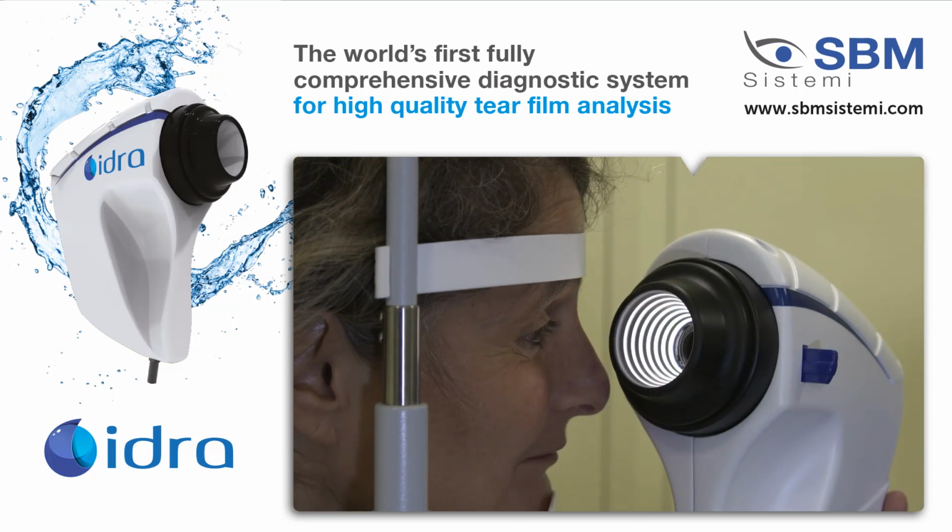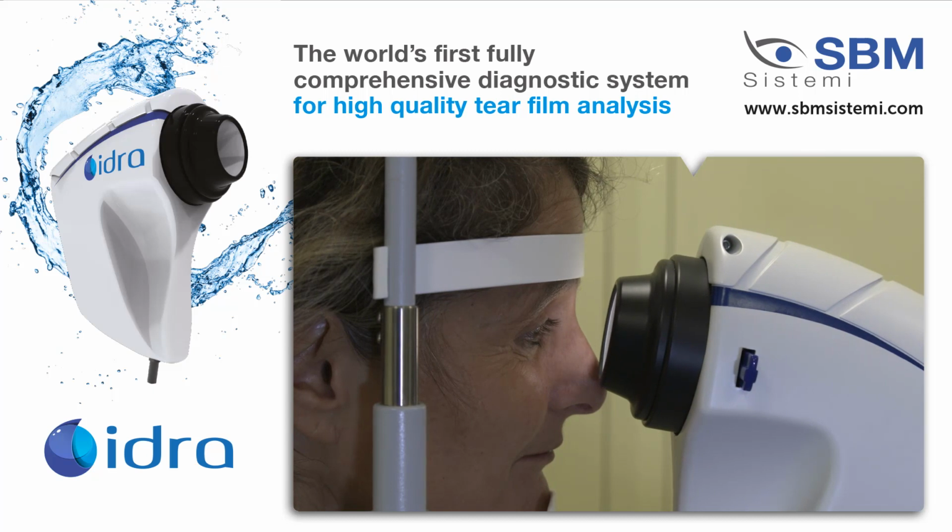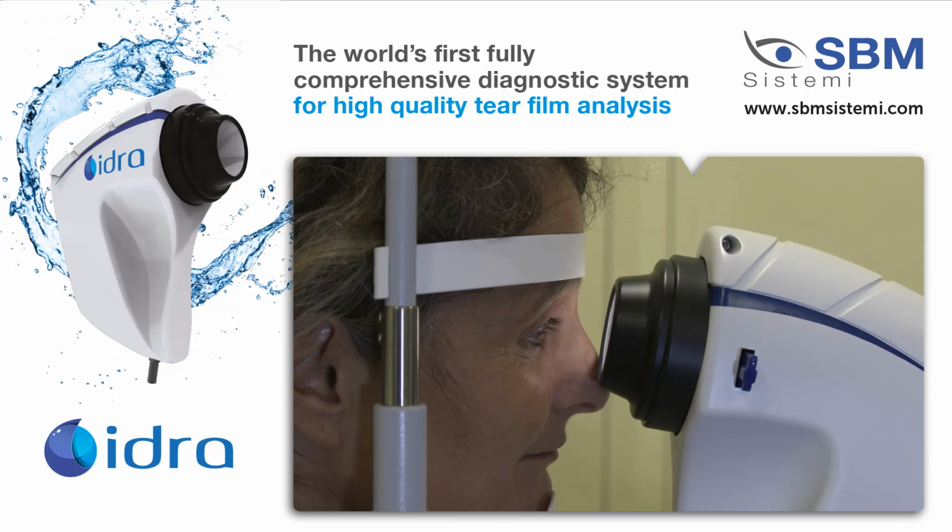To perform the non-invasive tear breakup time, we use the Placido disc, bring that in front of the patient, focus it on the cornea, and then ask the patient to blink twice, and then stare nice and wide. Keep staring. That's great. We then have a measure on the computer, a digital objective measure of the tear breakup time. We may repeat this 2 or 3 times so that we actually get that recordable, repeatable, non-invasive tear breakup time.